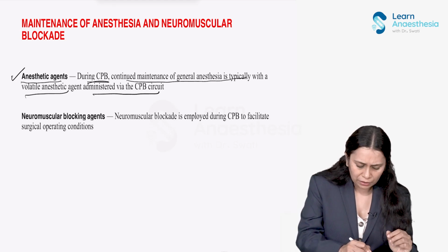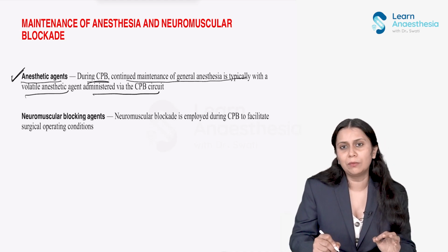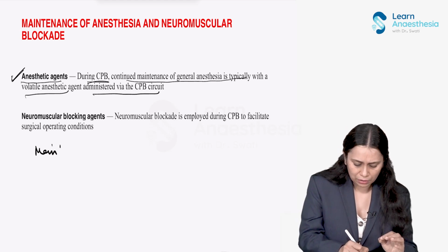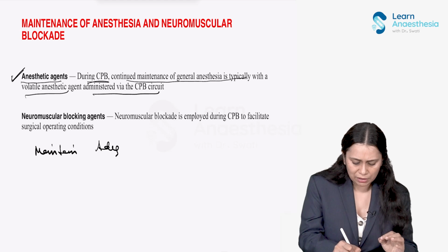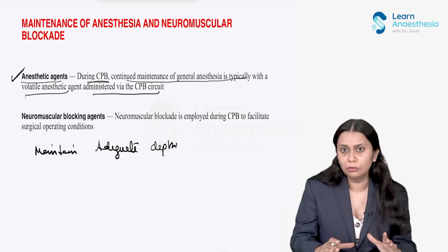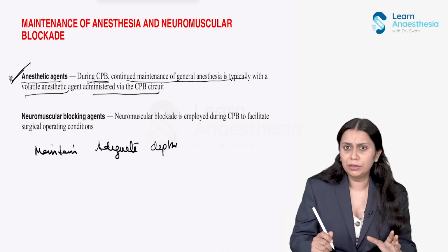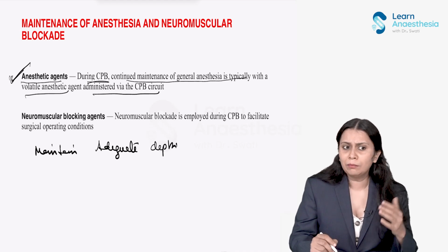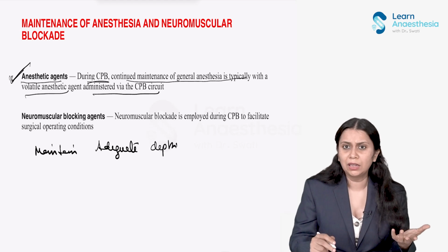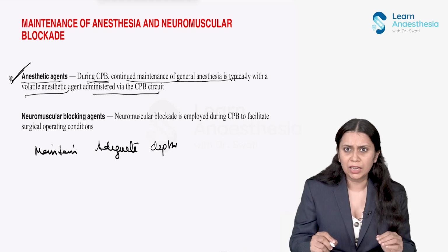We have to maintain the adequate depth of anesthesia. BIS monitoring would be very helpful. So we have to maintain adequate depth. A number of studies have shown that if adequate depth of anesthetic agent is not maintained during CPB procedures, the patient has a lot of incidents of recall and awareness, which leads to post-traumatic stress disorder. So we need to maintain adequate depth. If possible, attach the BIS monitoring.